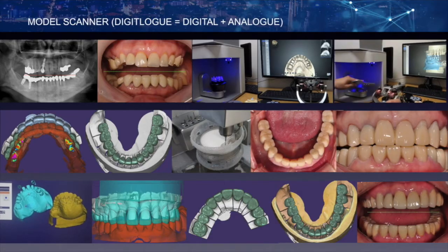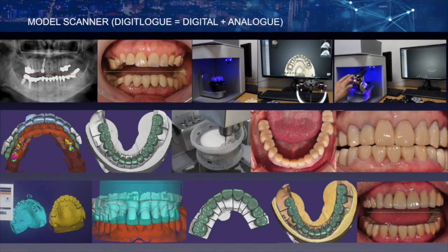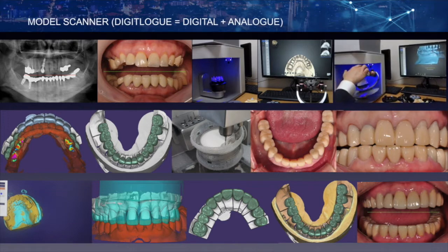Although the performance of the intraoral scanner has improved dramatically, I used a model scanner and semi-adjustable articulator for the broad area of occlusion reconstruction over the complete arch. The set values for the articulator can be entered into the virtual articulator of the CAD software to perform the same operation digitally with the lateral check bites.